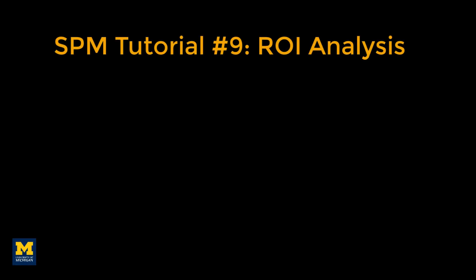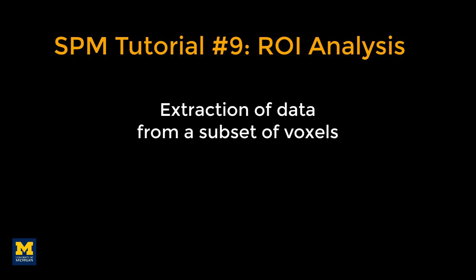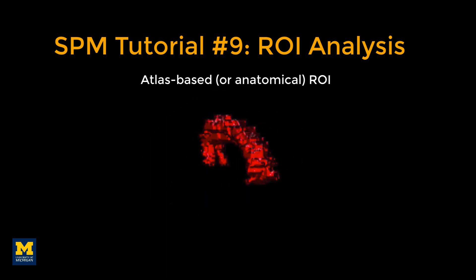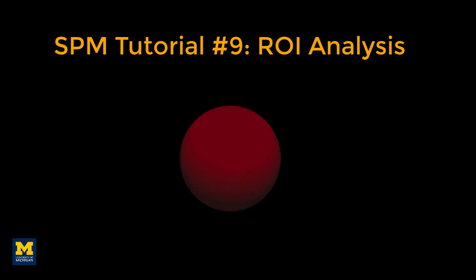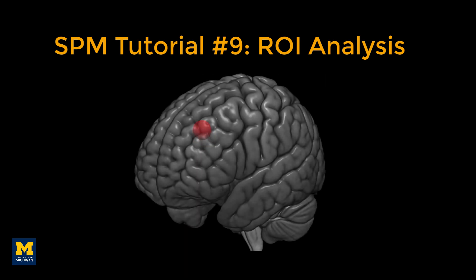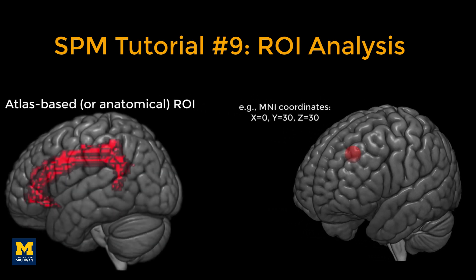A region of interest, or ROI analysis, is a method of extracting data from a subset of voxels, also called a mask. One way to create a mask is to use an atlas, or a map that partitions the brain into anatomically distinct regions. Another technique is called the spherical ROI approach, in which a sphere of a given diameter is centered at a triplet of specified x, y, and z coordinates. These coordinates are often based on the peak activation of another study that uses the same or a similar experimental design. In this tutorial, you will learn how to do both types of region of interest analysis.